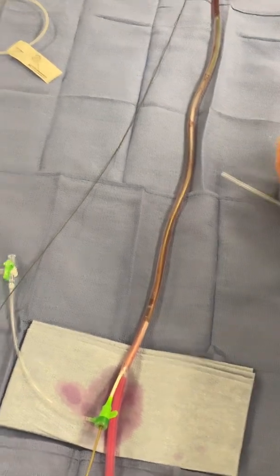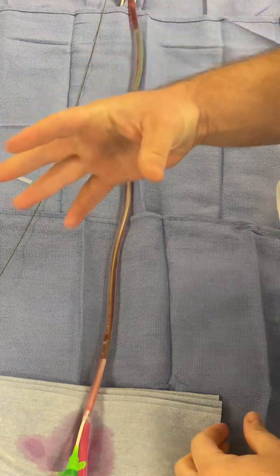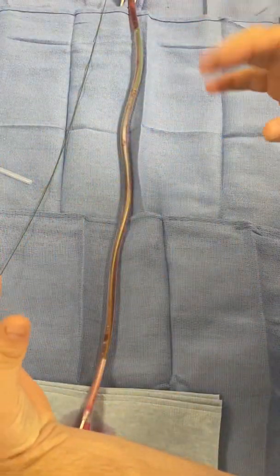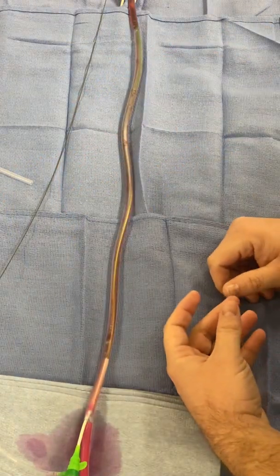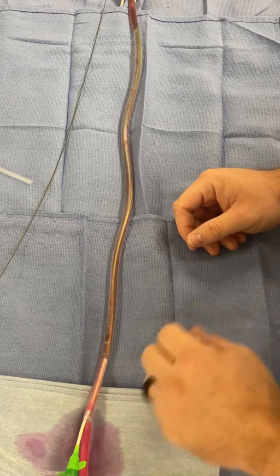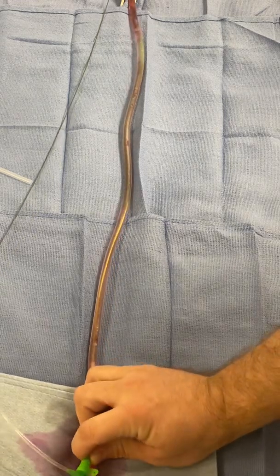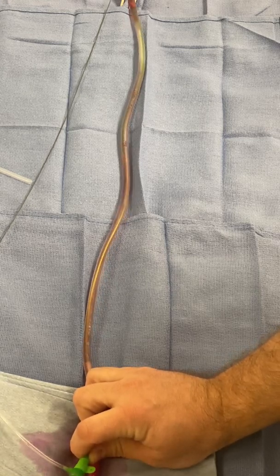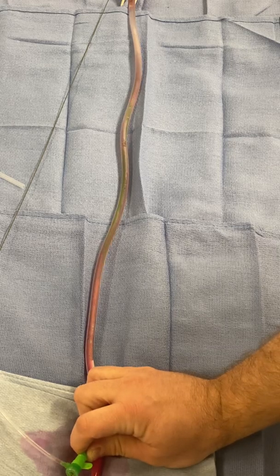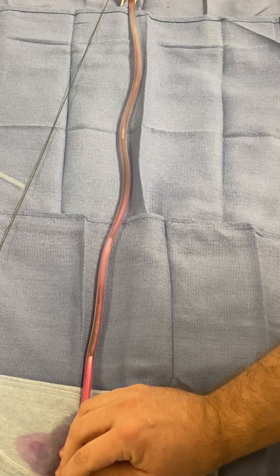You can see my clot has come all the way down. It's a very fast device for large clot burden — very powerful. The saline comes out of the catheter tips on most of them at greater than 300 miles per hour. This is called the Bernoulli effect — it's a backwards-spraying catheter, and when it does that it creates a vacuum void. In that void there's less than 600 millimeters of mercury vacuum, which is a large vacuum. I can continue to go, following down the catheter — it's a 90 centimeter — and come back. You can see the catheter tip actually spraying; the clot, blood, and everything go through the side holes.